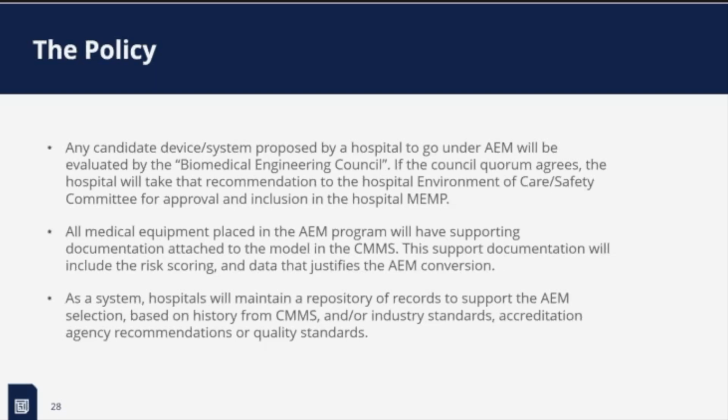The Joint Commission is getting more strict on that, making sure you have credentials behind it, that you have the skills to determine something like this, and it's not just a lower level, new tech who put all this together. You do have to have the credentials behind it. But is it one person or a group of people? Okay, Service Excellence Committee.